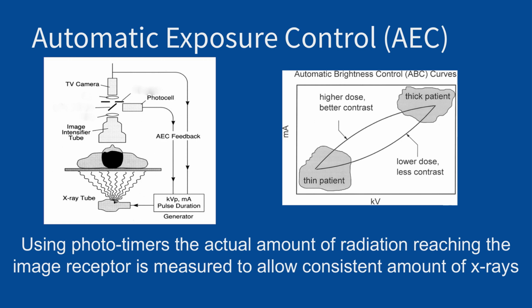If you're looking at an area that is more difficult to penetrate, thicker, like the abdomen, you will obviously require increased X-ray delivery, an increased amount of X-rays, and that delivers increased doses to, again, both you and the patient.